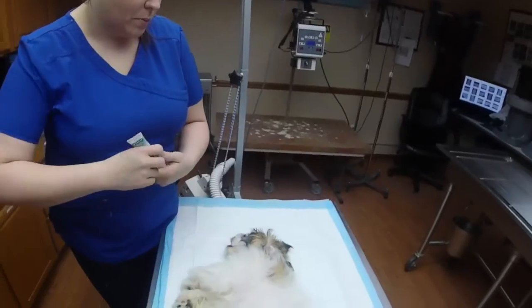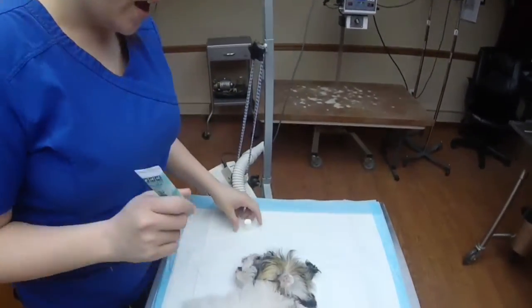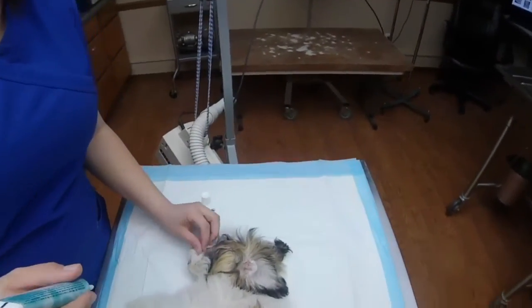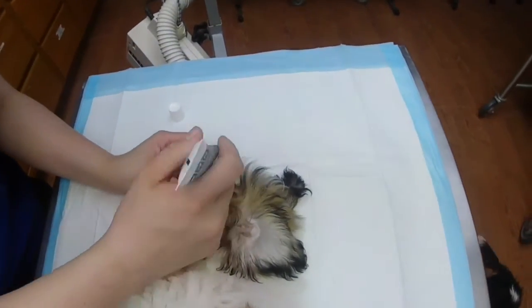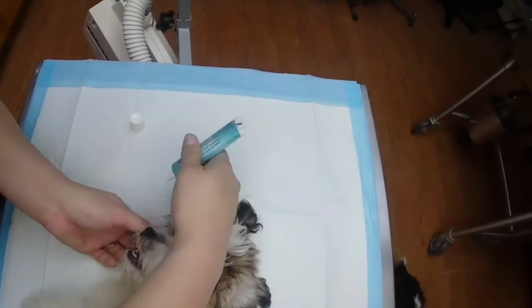Just quickly, this is applying eye lube so they don't have dry eyes, and you will cause a corneal ulcer if you do not give this.